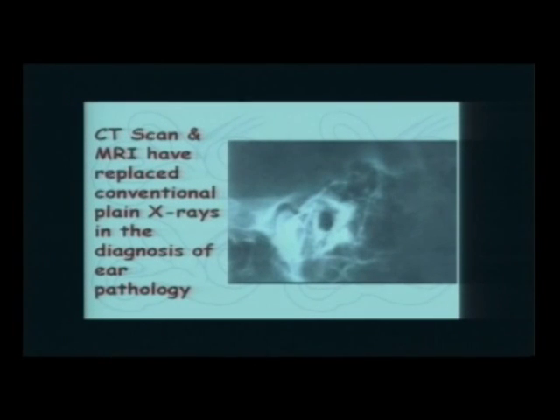So, does anybody really want to have this X-ray in your centers? Does it have any value? No value whatsoever. I'm still astonished that some surgeons insist that the patient in preparation should have a mastoid X-ray. This is not cost effective at all. You don't get any information from this X-ray. You don't have to have a CT scan for every patient, for example, with a simple perforation. You already see that clinically.